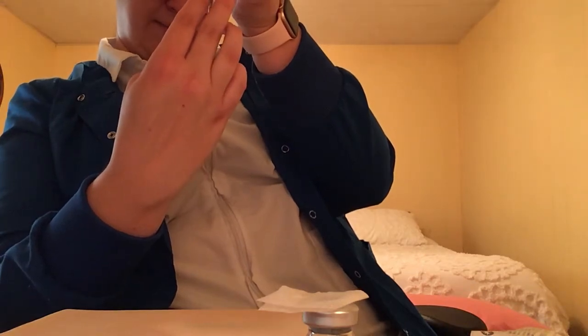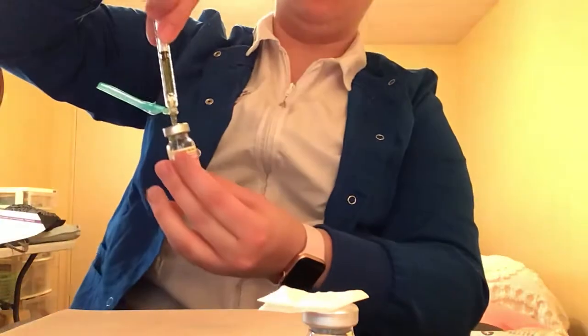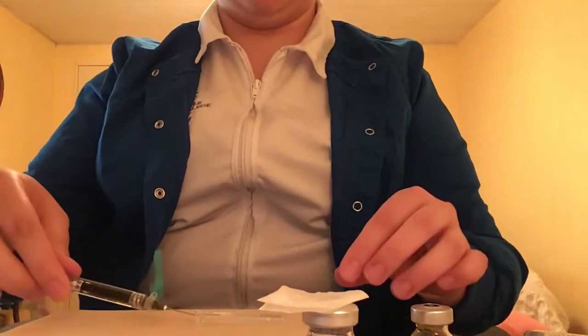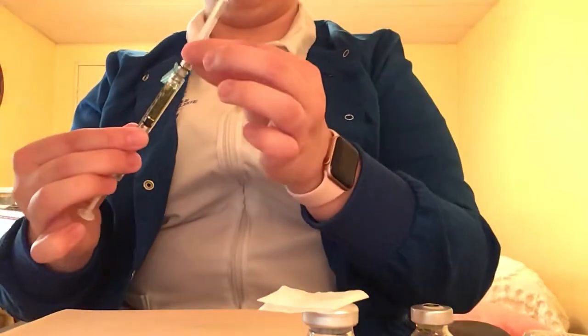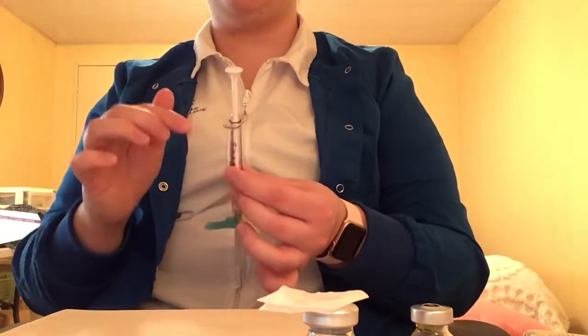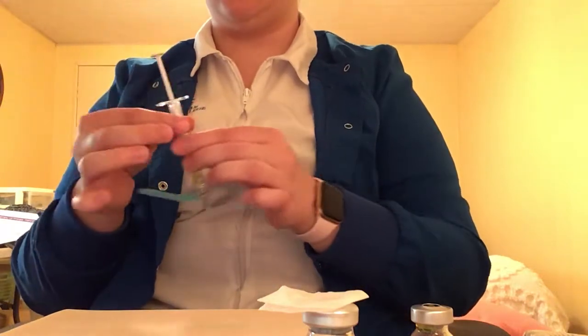I'm doing this as close to eye level as I can so you can still see. Okay, and now I'm going to withdraw my needle and I'm going to passively recap. I don't know if you can see that. And now I would make sure that I label my syringe with my initials, date and time, the patient's name, and the medication and dose.